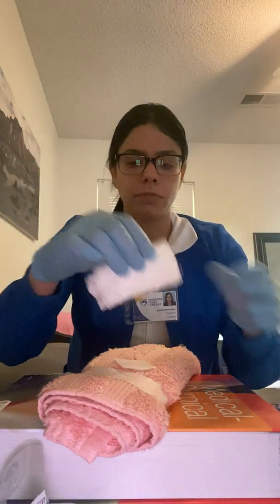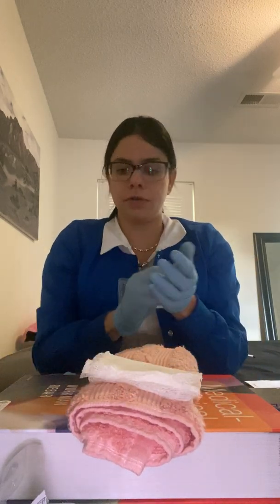All right, so I'm going to be using my gauze at the injection site. Not a lot of pressure, just a little bit. You can also use a bandage if you want to. I'm going to take my gloves off and dispose of them. And then I am going to take all of my garbage, all of the stuff that I don't need, and dispose of it. My vial, since it's a multi-use vial, I'm not going to dispose of it. I'm just going to put it where it belongs.